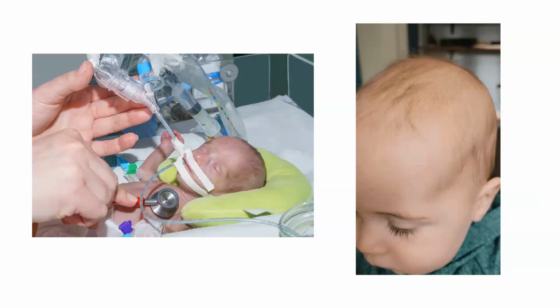The beauty of this course is nobody is wrong. There's never a wrong answer when I ask a question. You're all right. It may be the case that you're looking at an extremely preterm baby who's 500 grams, and actually a frequency of 8 may not give you such good resolution. So you may have to increase the frequency. In general, the rule of thumb is that a frequency of 7.5 to 8 really is the best compromise of resolution for near term and term babies. But when you're extremely preterm, you might need a slightly higher frequency.